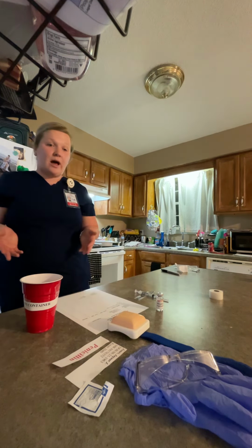Now, since this is an intramuscular injection, the most preferred site for this medication is the ventrogluteal, and I can find it by putting the heel of my palm on the greater trochanter, which is on your thigh, and I would point my thumb towards the groin area, my pointer finger towards the anterior superior iliac spine, and my middle finger would go towards the iliac crest.